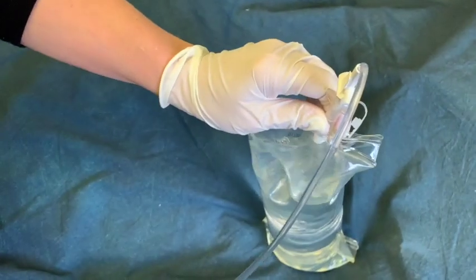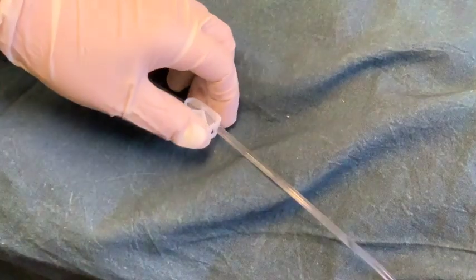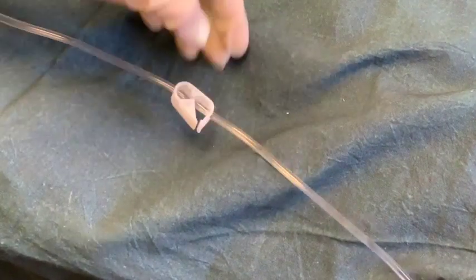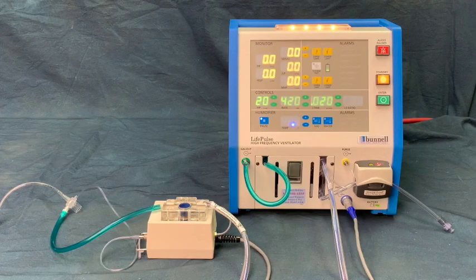The water supply should be positioned at or below the level of the humidifier cartridge. Be sure to unclamp the water transfer tube. The patient breathing circuit is now ready for testing. Call the Banel hotline for help at any time.